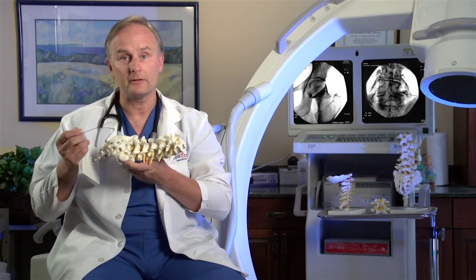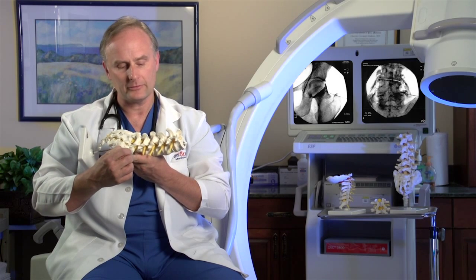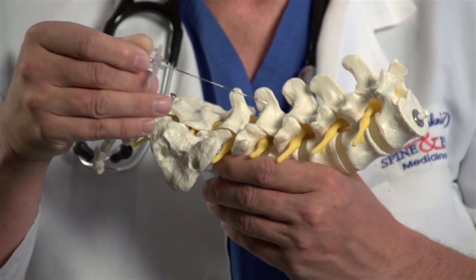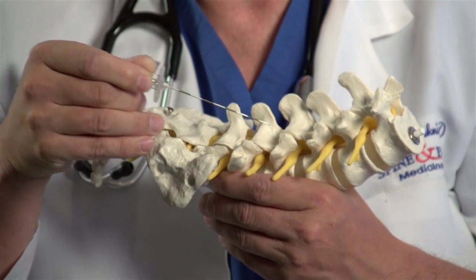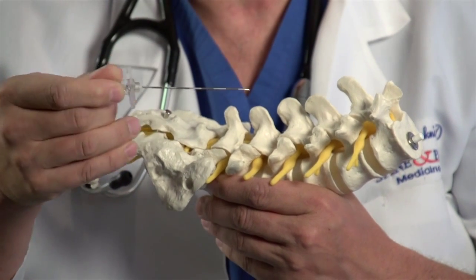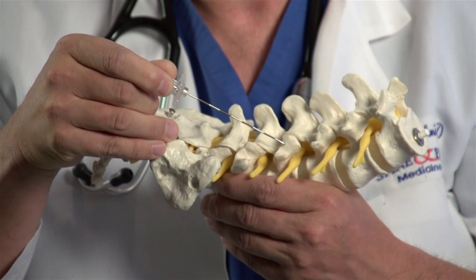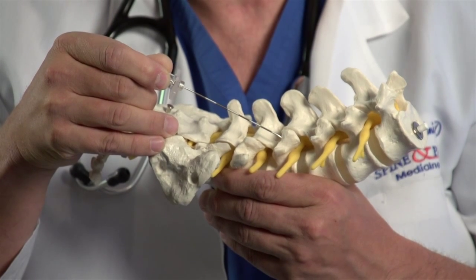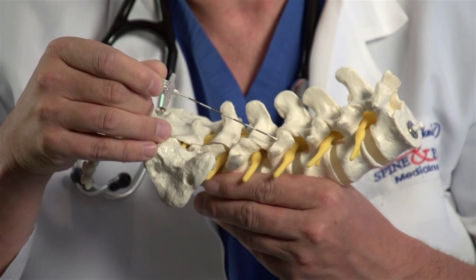I'll demonstrate on this model as to where the nerves may be. Pain from the joints of the low back is carried by a little sensory nerve from that particular joint. Radiofrequency denervation is achieved by placing a needle under local anesthesia to the little sensory nerves that bring sensation to the various joints within the lumbar, thoracic, and cervical spine. Once I see that the needle is in place under x-ray, I check with a special machine connected to the needle to make sure the needle is sitting just on the sensory nerves to the joint and not near any of the other larger nerves within the lumbar spine.